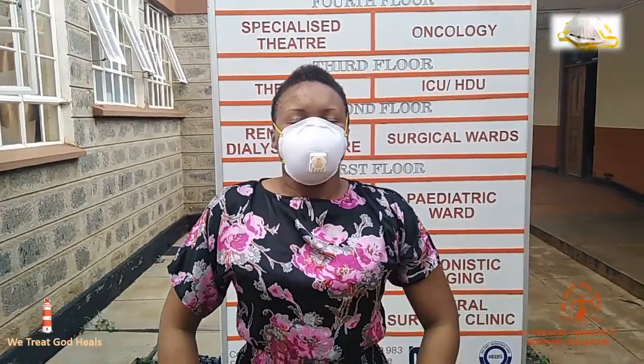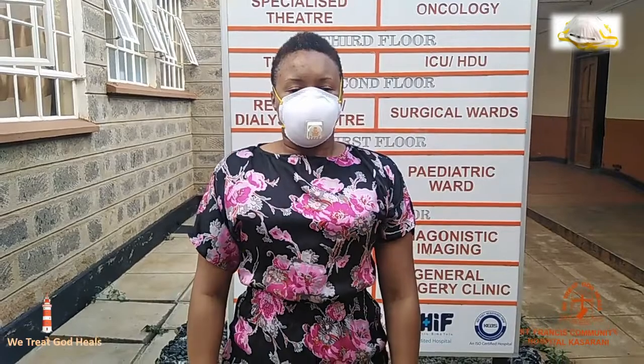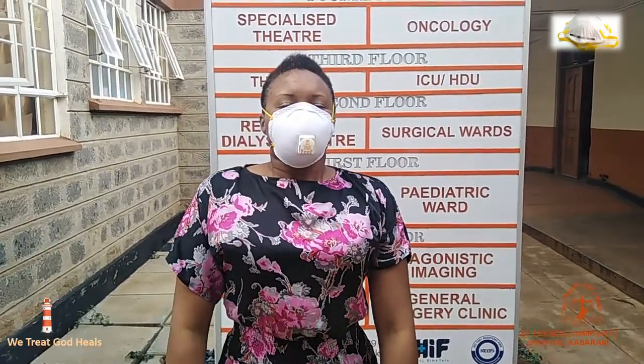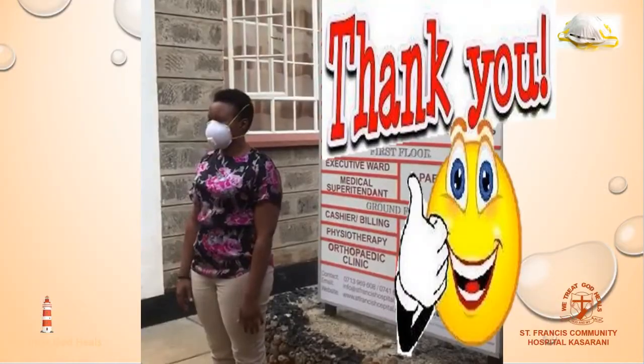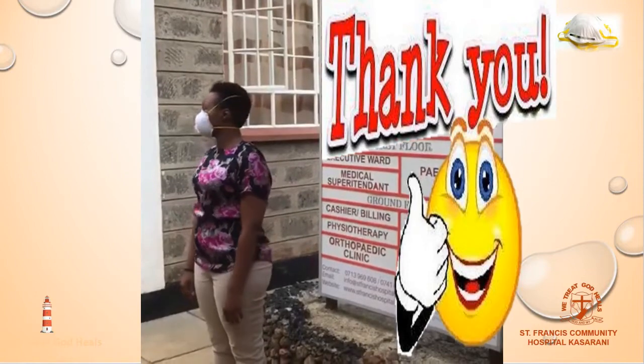Perform a fit check by breathing in and out. Check for air leakage around your face while breathing out. Great! Now you're protected.